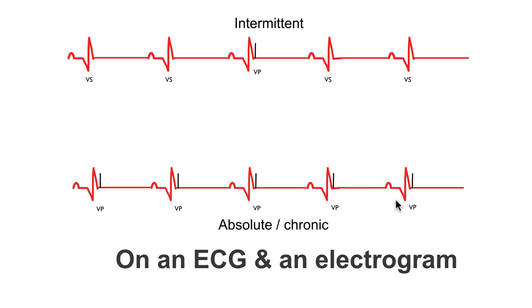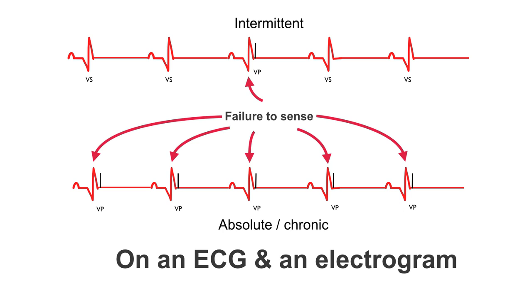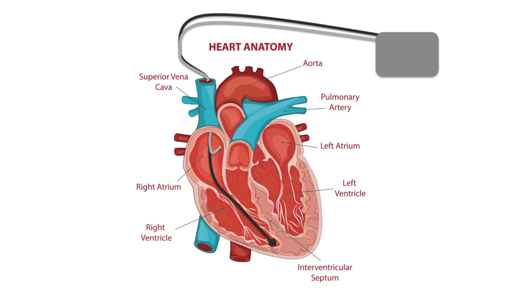This happens on all of the heartbeats on this electrogram, and so we would say that this is permanent, absolute, chronic under-sensing. I've marked all the events where the pacemaker fails to sense on the electrograms.